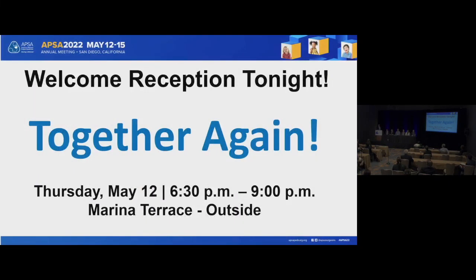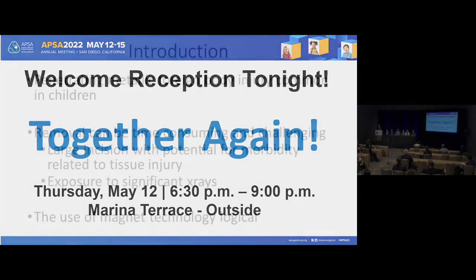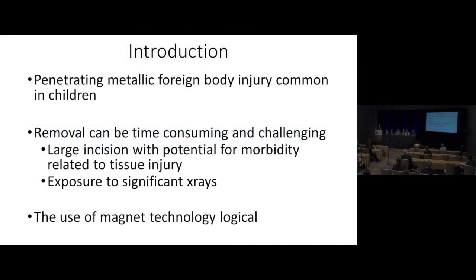Penetrating metallic foreign body injuries are common in children. Once embedded in the soft tissue, these objects can be challenging and time-consuming to remove, often requiring a large incision and soft tissue destruction to gain access to the foreign body. This procedure often requires fluoroscopy, exposing the child to significant ionizing radiation.